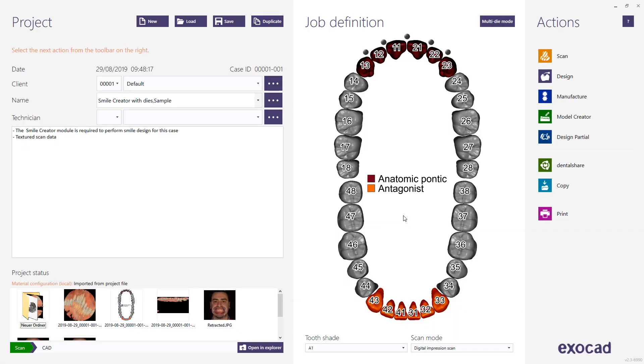This video tutorial from Exocad will show you how you can achieve a simple Smile Creator design, completed in just a few steps.